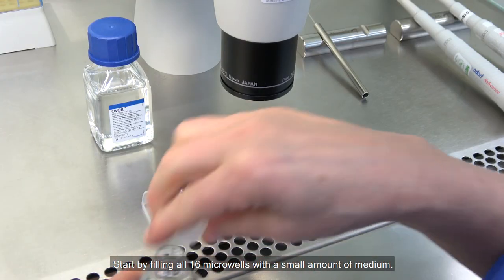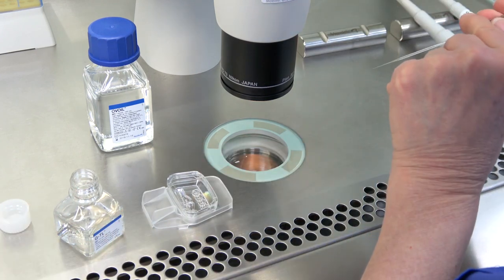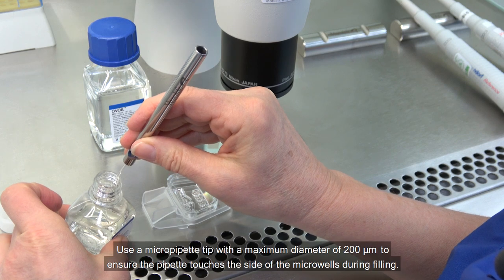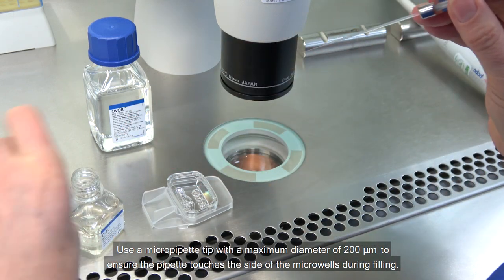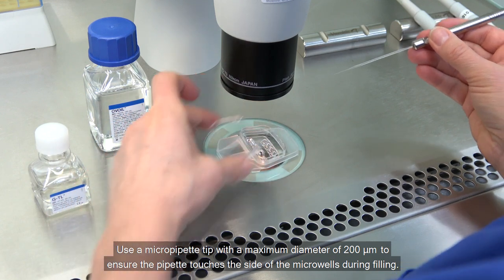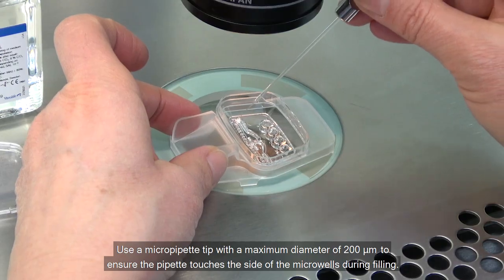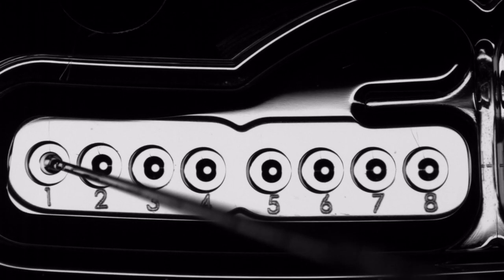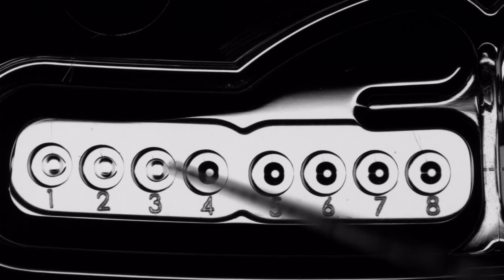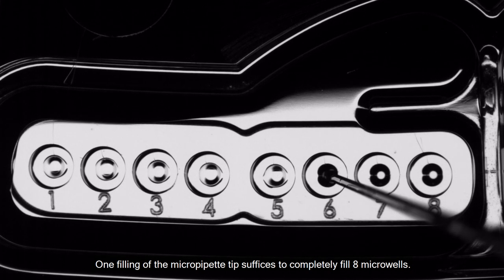Start by filling all 16 micro wells with a small amount of medium. Use a micro pipette tip with a maximum diameter of 200 micrometers to ensure the pipette touches the side of the micro wells during filling. Slightly overfill the micro wells. One filling of the micro pipette tip suffices to completely fill 8 micro wells.